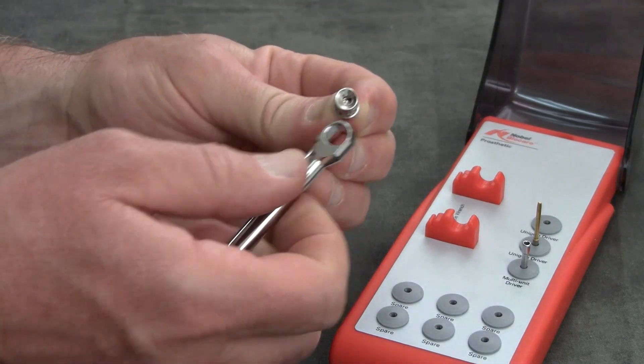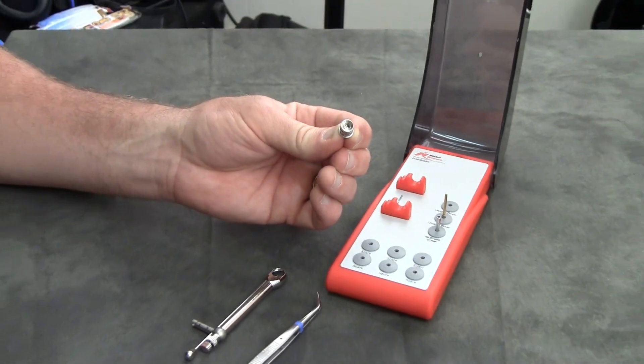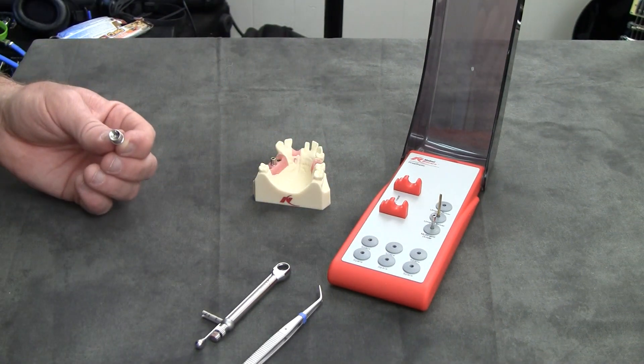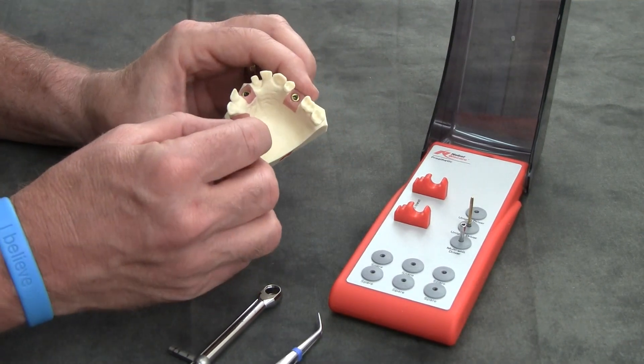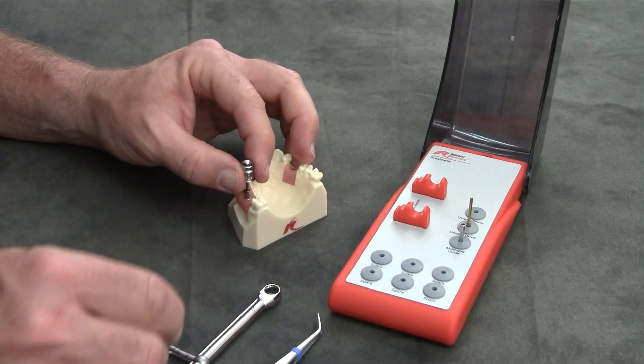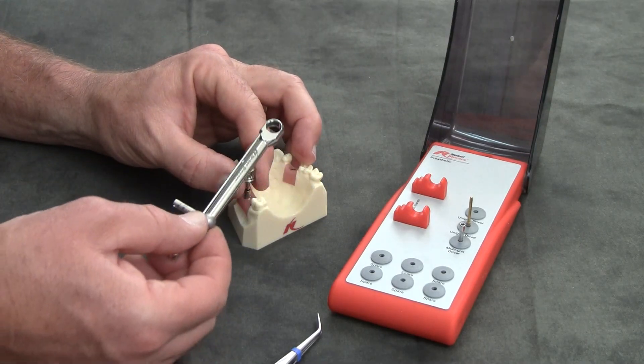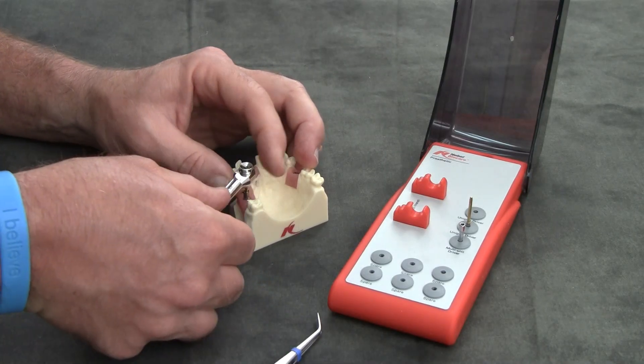The easiest way to tighten your screws using the torque wrench is to start by hand. Take this screw, tighten as tightly as possible by hand, and now the torque wrench coming again from the bottom. Engage, snap.